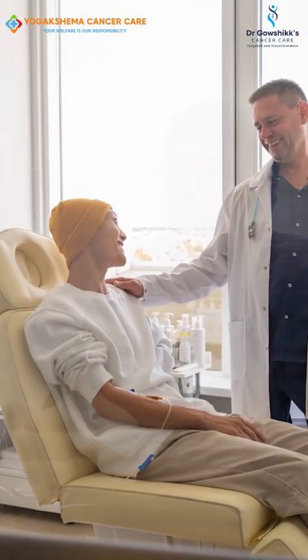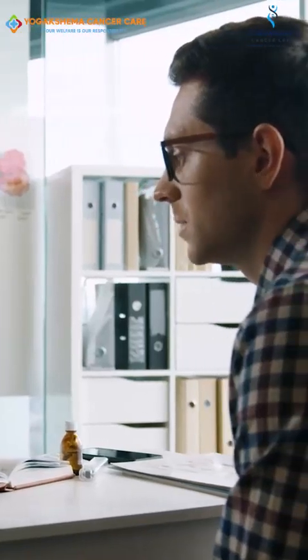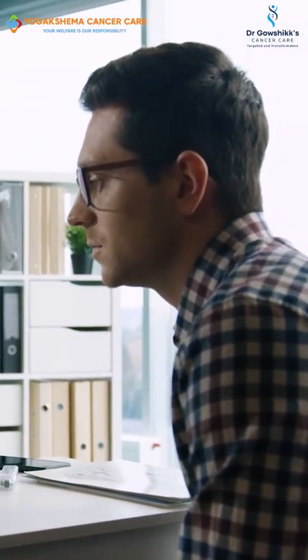In contrast, the IMRT patient, that 38-year-old person, will come back to me within, say, 18 or 19 days saying that he's having a lot of difficulty swallowing, a lot of pain due to the radiation effects, and all that. So it means the radiation delivery is better with arc therapy when compared to the previous technique I mentioned. I hope this gives you clarity with regards to radiation therapy.